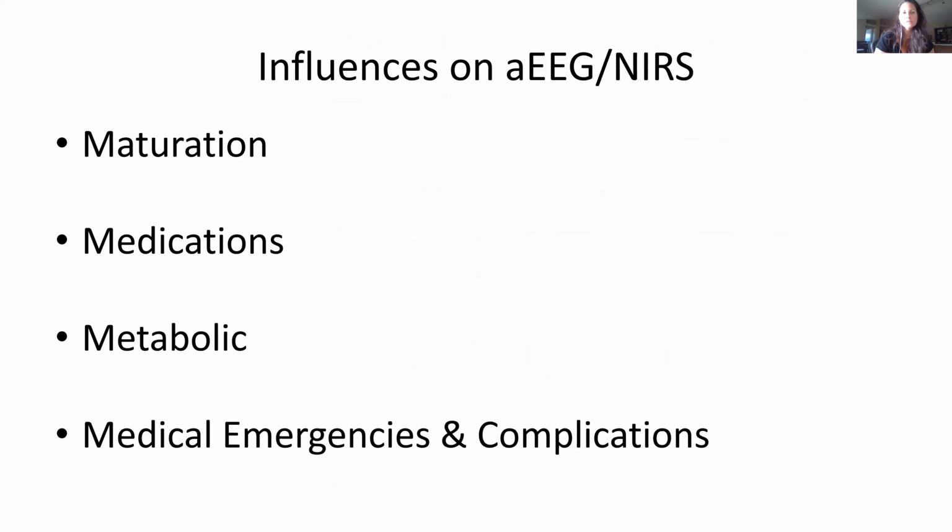So last month, we did start talking through some of the influences. So these are mostly, you know, other than maturational, which I think is cerebral, everything else is kind of extra cerebral. Things that either are happening to the baby or situations that are influencing cerebral function. So of course, maturation, you know, we've done previous calls just about maturation and prematurity, and we know that, again, the continuity increases as babies get older, so that bottom margin increases.